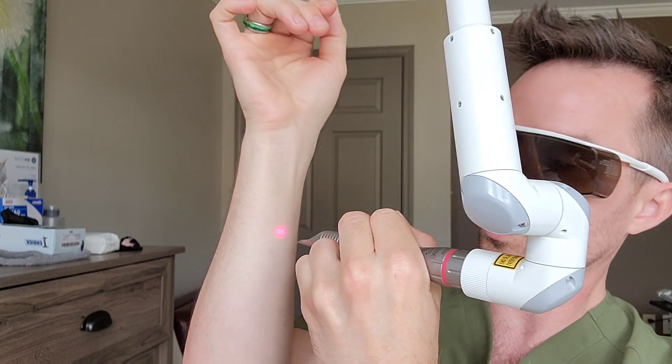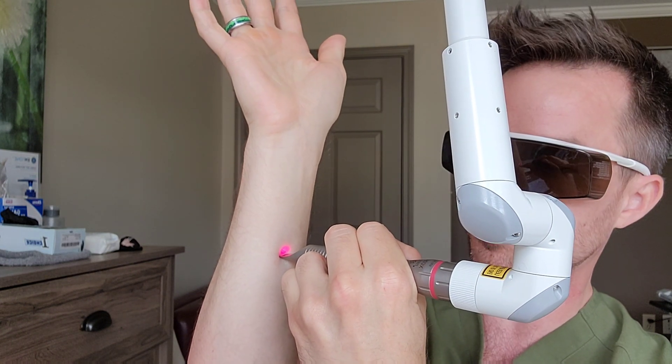Initial studies are showing that NightLase is as effective as CPAP for sleep apnea — very cool. Now if we do take it to levels where it ablates with a really quick pulse that has enough energy to ablate, you can see these little dots right next to that other mark. So that's the pixelated form. Generally we'd either go fully fractionated or use the full beam if we're resurfacing. We really want to use this pixelated mode when we're just trying to deposit heat to stimulate collagen without any downtime. Another use is around the eyes — what's called the Smooth Eye — to help tighten up those tissues.